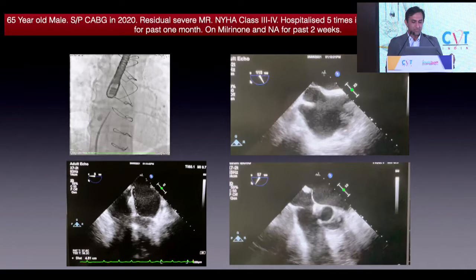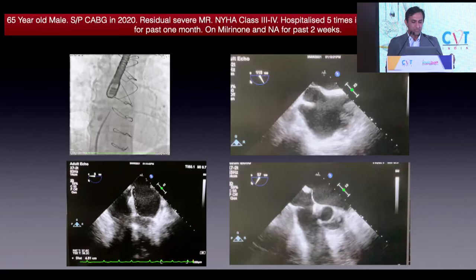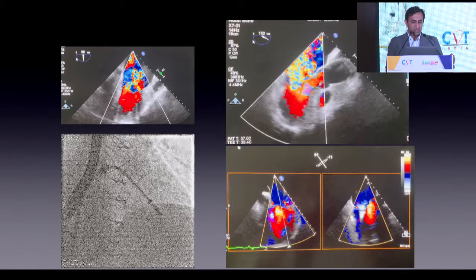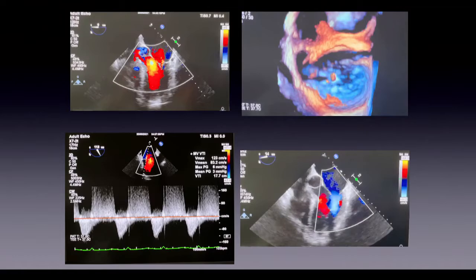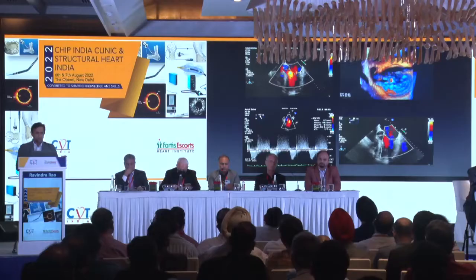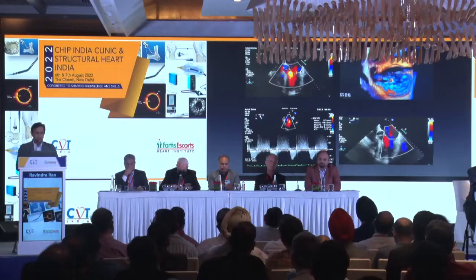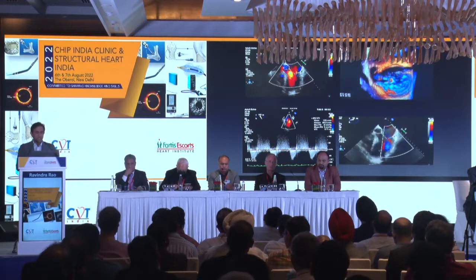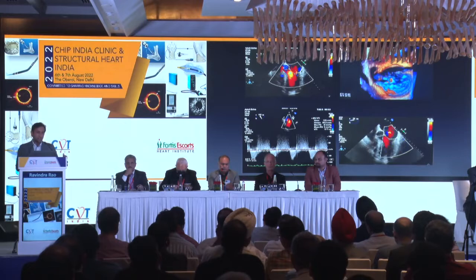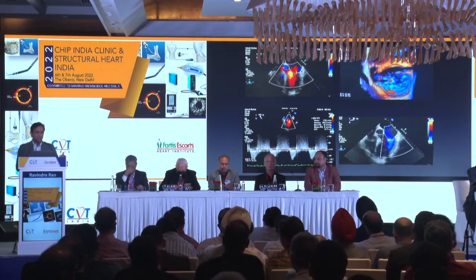Another case: severe functional MR with torrential MR on TEE and 3D TEE showing no mitral regurgitation after clip implantation. Remember, sometimes you can under-assess residual MR because the patient is under general anesthesia; you can raise blood pressure, give isoproterenol to increase heart rate, and reassess — this is how it looks on 3D TEE with deployed clip and trivial to mild residual mitral regurgitation.